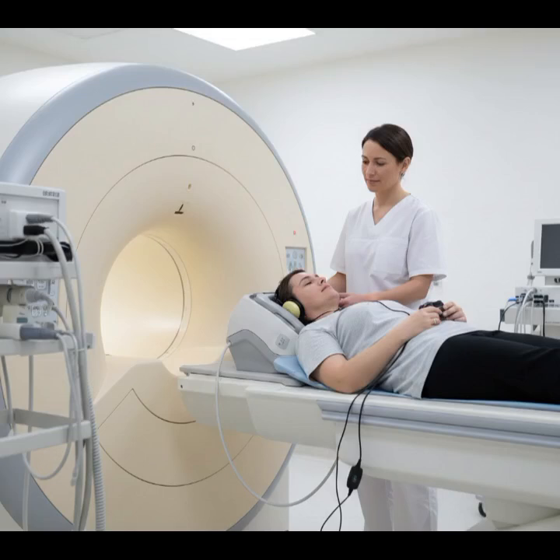Begin by welcoming the patient into the MRI suite and guiding them toward the exam table. Assist them in lying comfortably on their back and position their head gently inside the head coil. Provide an emergency call button, clearly explaining how to use it if they feel uneasy at any point. Place ear protection or headphones over their ears, then secure the coil around their head.